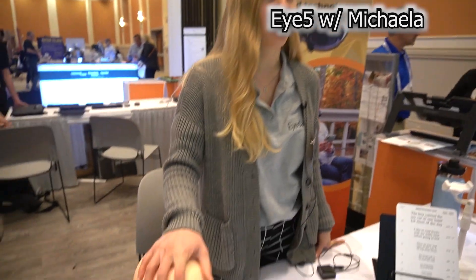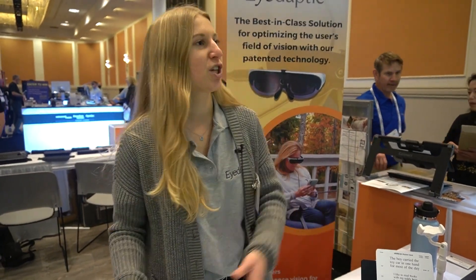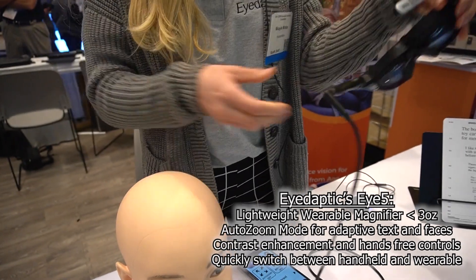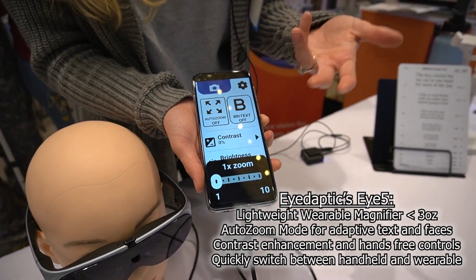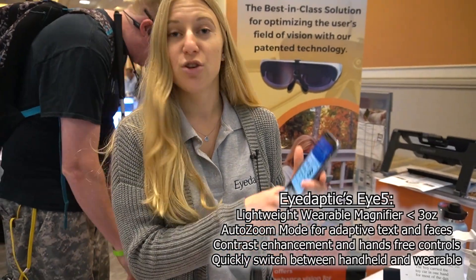TechConnect Live back on the floor here for CSUN 2023. We stopped at the iDaptic booth talking with Michaela about the new iDaptic i5. So this is our i5, our newest product — we just released it in October. It is our low vision assistive device, primarily for central vision loss. We're able to use people's remaining peripheral vision and manipulate the image. The glasses are very lightweight and sleek, more like sunglasses than electronic glasses. There's a camera in the center and we utilize that camera and display it on the two displays on the inside, and we also connect to our app on a companion phone.